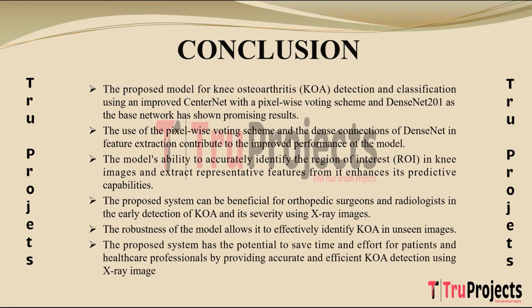By providing accurate and efficient KOA detection using X-ray images, the proposed system has the potential to streamline the diagnostic process. This efficiency can lead to time saving benefits for both patients and healthcare professionals, allowing for quicker assessment and appropriate interventions, ultimately improving patient care and management.